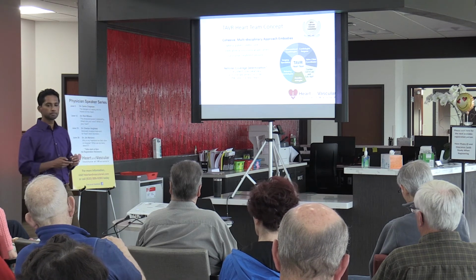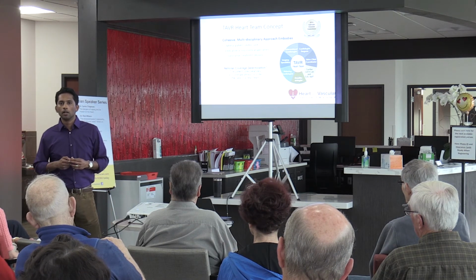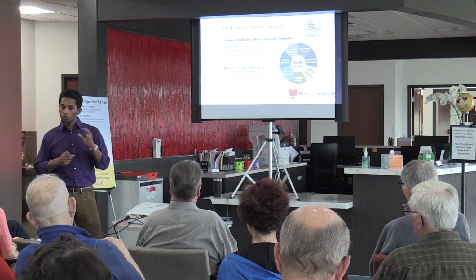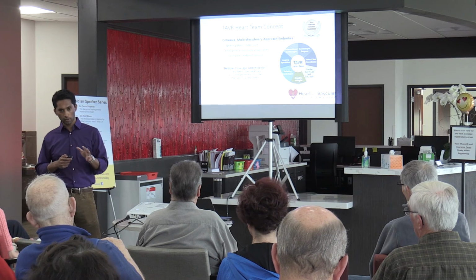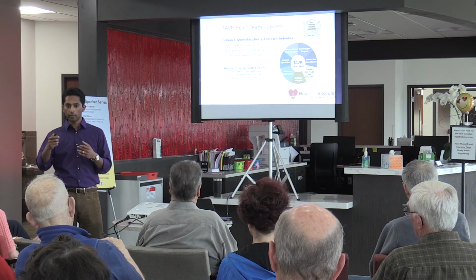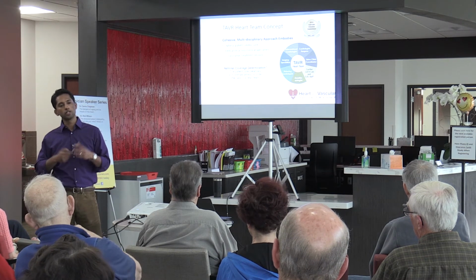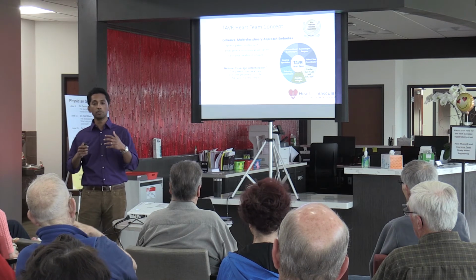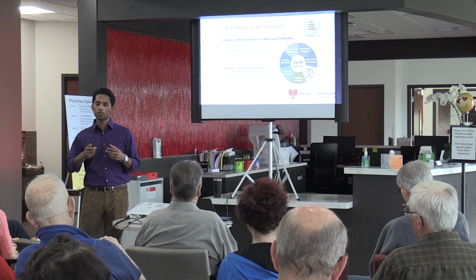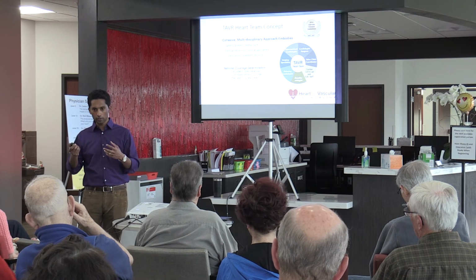Is there any difference between the outcomes with bicuspid versus tricuspid valve? So all the trials that looked at the use of the minimally invasive technology excluded patients with bicuspid valves for the most part. Now that being said, there has been a lot of analysis looking at bicuspid valve patients since then, and a lot of that data looks promising. And so now there's debate as to which technology in particular, because there are several companies that make TAVR valves. Is one technology, is one method better to treat bicuspid valves over another?